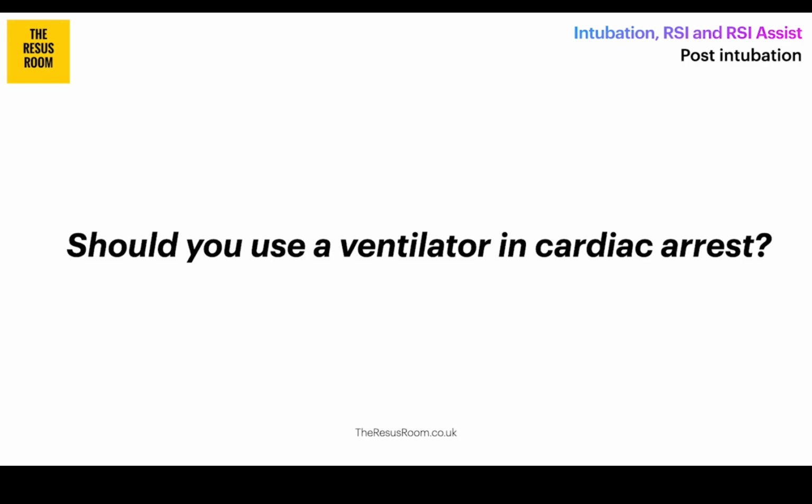However, there is some good evidence around the utilization of ventilators, and it does suggest they certainly can be used even with chest compressions ongoing. So potentially this is definitely something you could try, specifically in those prolonged arrests is where I'd consider it most. So for example, cases where you're trying to correct a hypothermic cardiac arrest, or a patient who's taken an overdose and we know this is going to be a long resuscitation effort, or in those patients who are being thrombolysed for, say, a massive PE, etc.